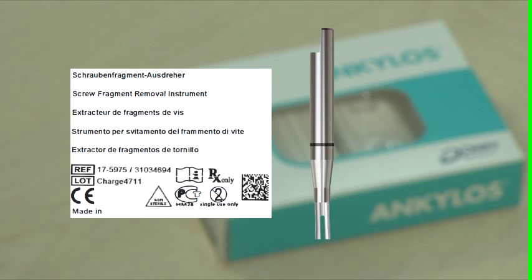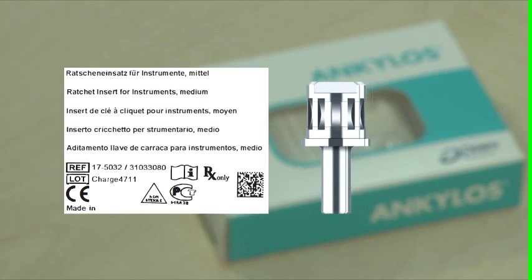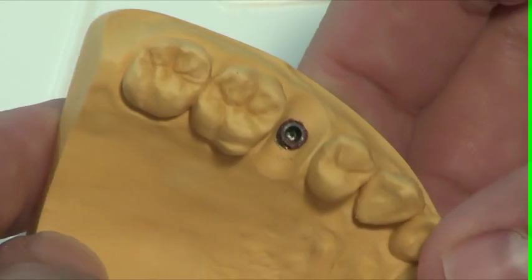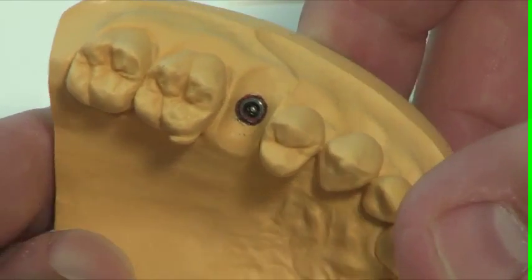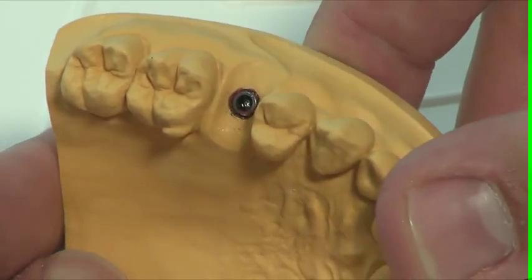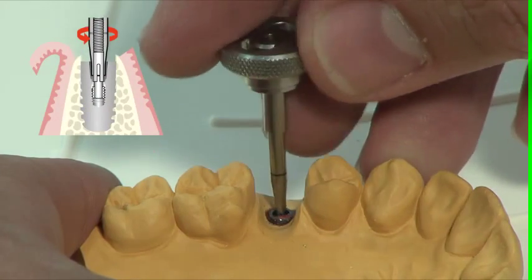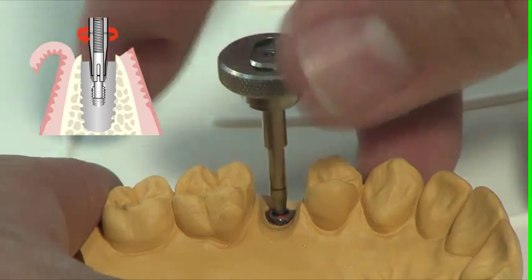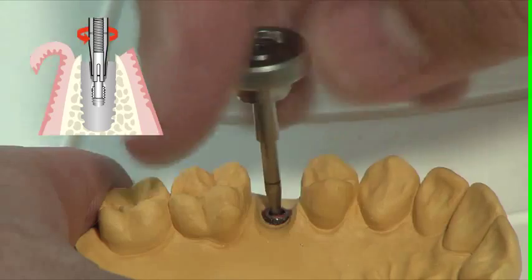Just like the screw tap, the screw fragment removal instrument is used together with the ratchet insert for instruments and the handle for the ratchet insert. Place the tip with open jaws over the screw shaft and unscrew the screw fragment turning in a counterclockwise direction.